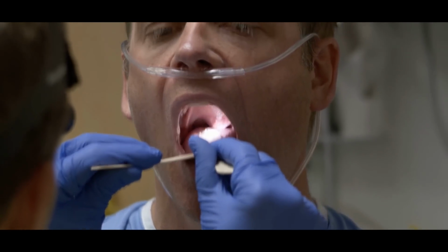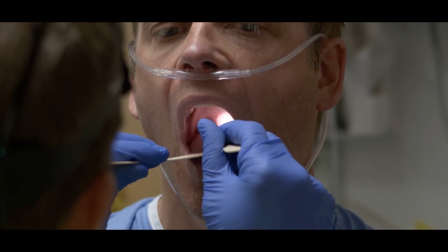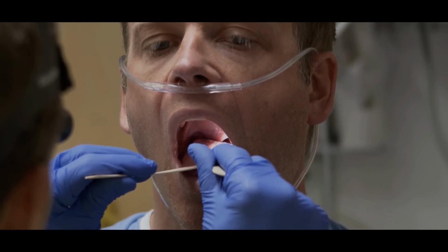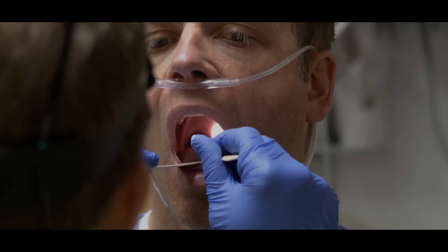Just kind of massaging that into the tongue. And the other trick with this is put the lidocaine right at the distal end of the tongue depressor, so therefore your tongue depressor isn't going beyond where you've frozen, and in that scenario will be more likely to induce a gag.